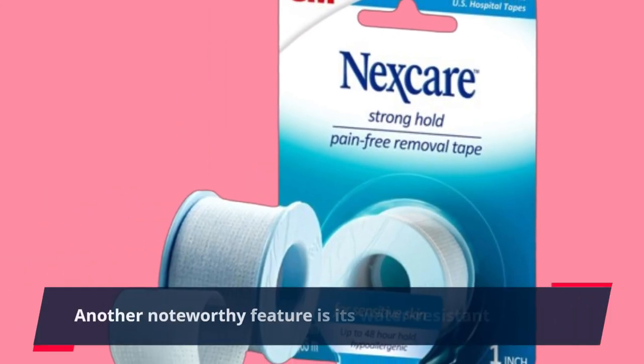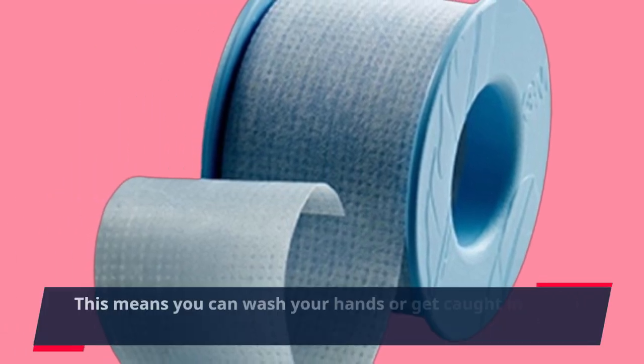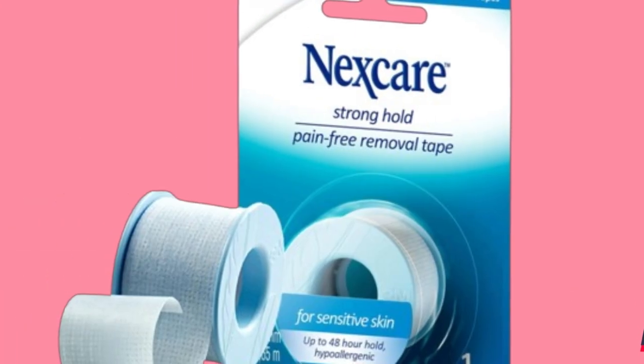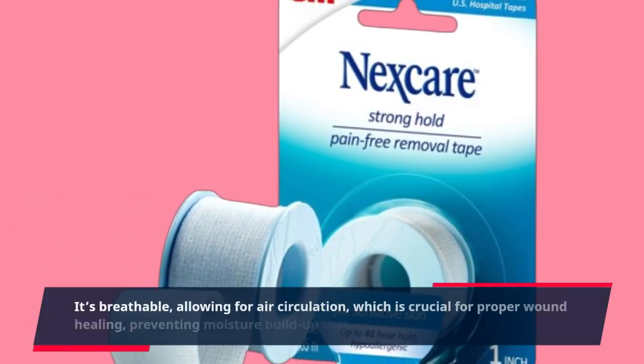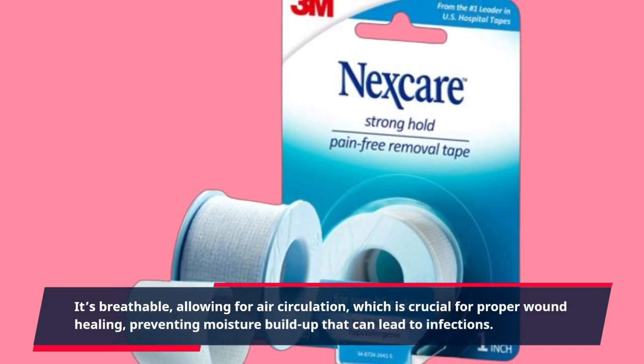Another noteworthy feature is its water-resistant design. This means you can wash your hands or get caught in a drizzle without worrying about the tape losing its grip. It's breathable, allowing for air circulation, which is crucial for proper wound healing, preventing moisture buildup that can lead to infections.